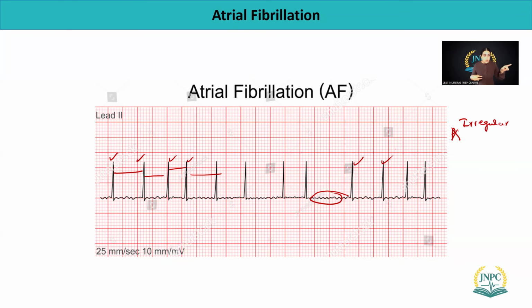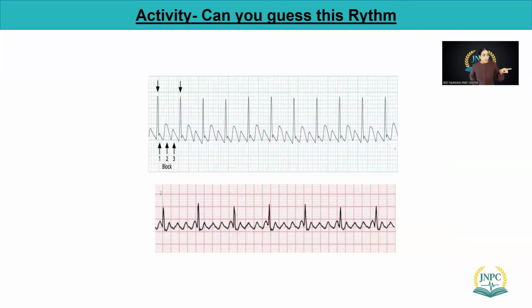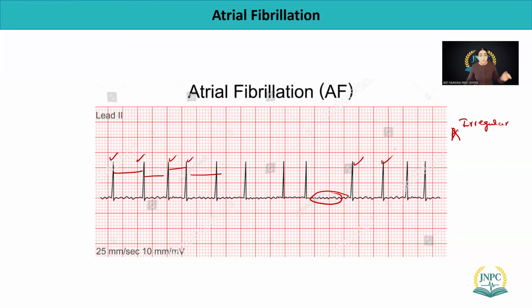So any issue with the atrial fibrillation? No, right? Okay. So before I do the next one, I have to focus on this atrial fibrillation. So there are two things which are very important. One is the clot. Second is the body is not getting cardiac output, or I would say oxygen is low. It's going to be low, of course. Body is not going to get oxygenated blood. So treatment is going to be super, super important.